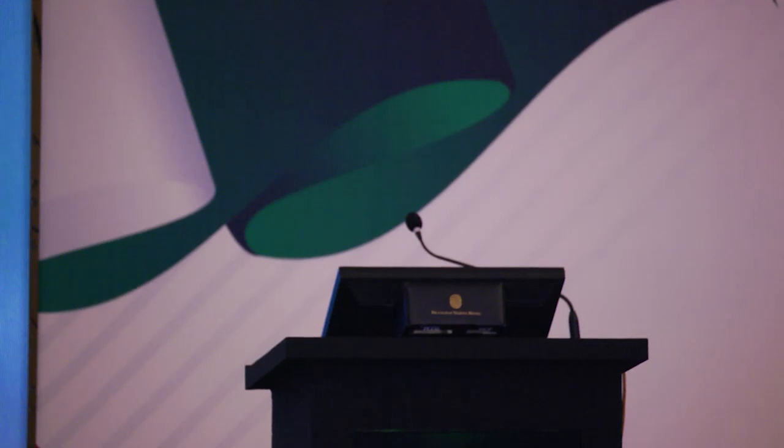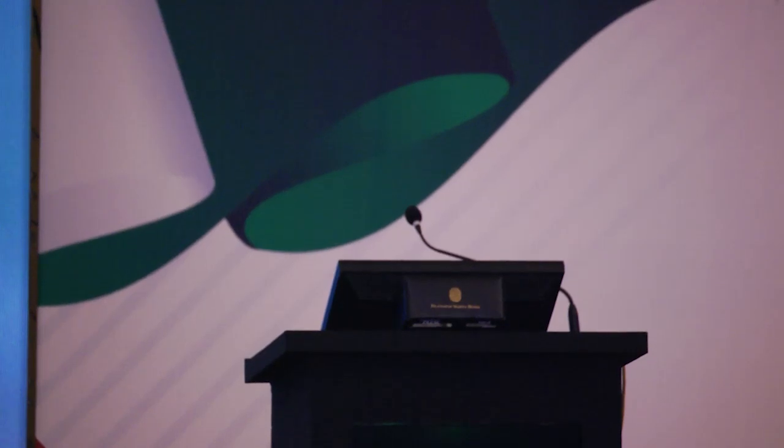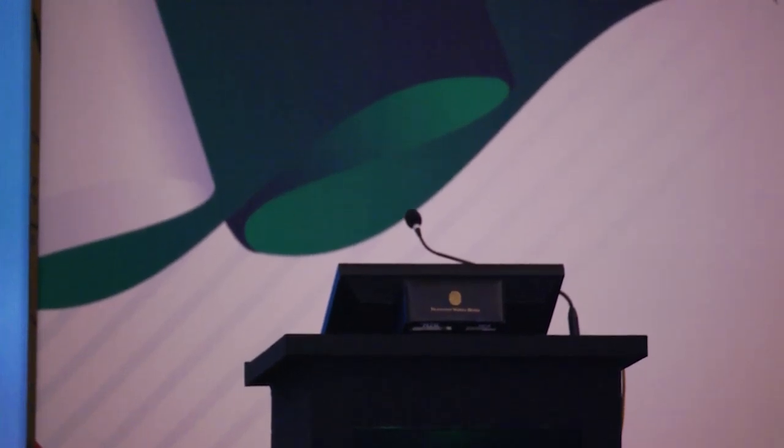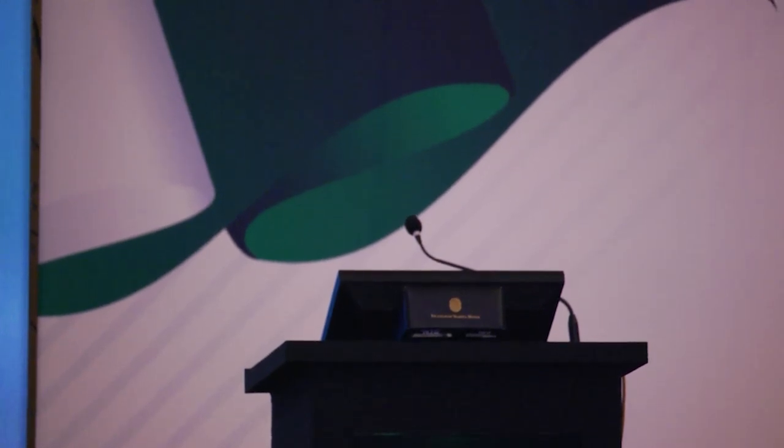So what I have been charged to do in the next few minutes is to give a broad overview of the area that I work in, which is structural heart disease. And I hope I can transmit some of the excitement around the innovation in this field and the challenges. So I'm going to start with sharing my screen.